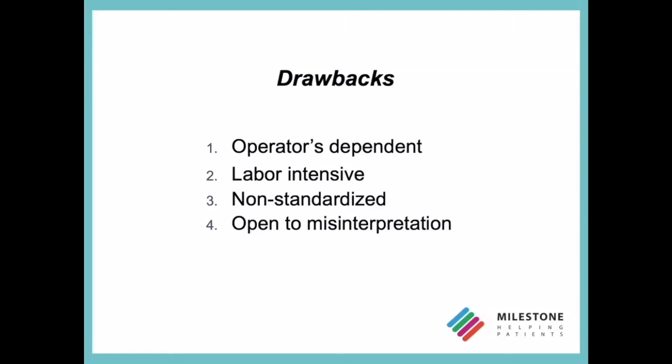These procedures are labor intensive, take time to describe and even more to properly draw the tissue and add all the relevant notes. These procedures are also not standardized because every operator uses a different set of words and may have a different perception of colors and maybe dimensions. All this information, even if carefully collected, could sometimes be misinterpreted by the pathologist when analyzing the slide.